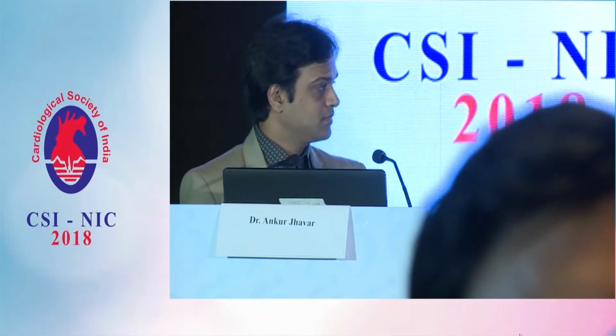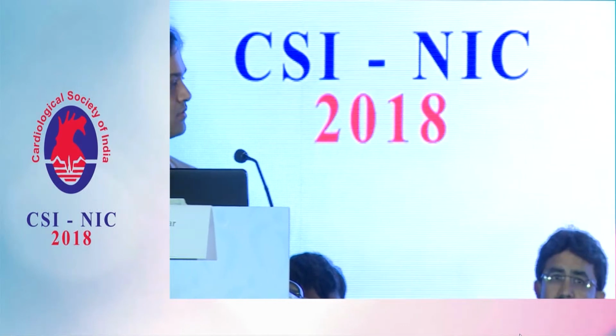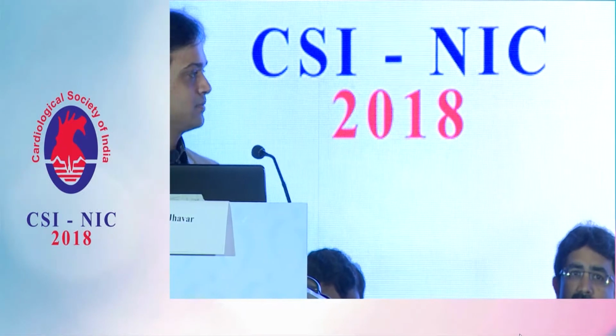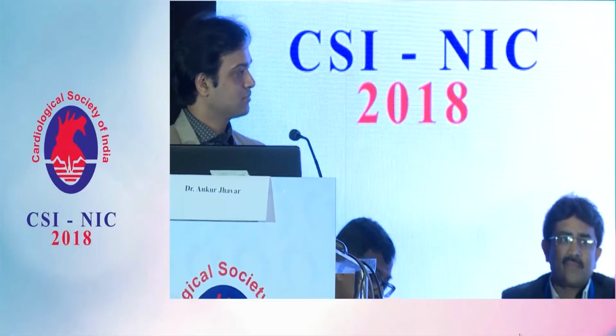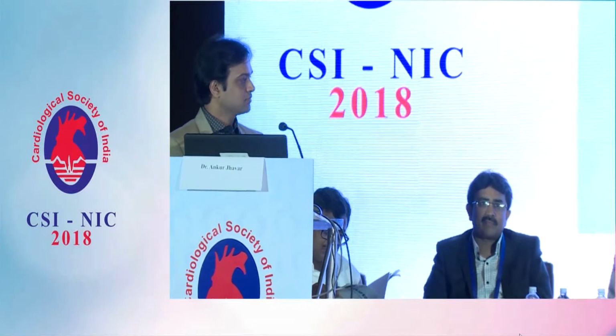I think with use of StentBoost, you are able to really see how much you're protruding back. Yes, sir. And that would allow you to convert too much protrusion into a crush, a reverse crush. I think very well done. Otherwise we could have been left with too much stent protruding into the. Yes. See, in T with protrusion, you are creating two parallel barrels. So it must have just adequate.